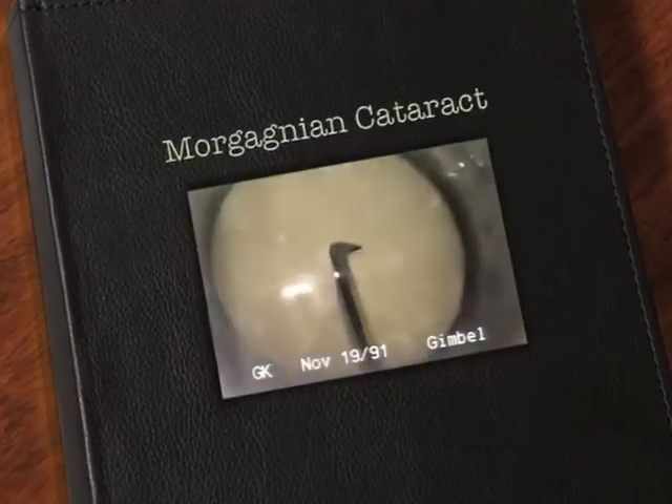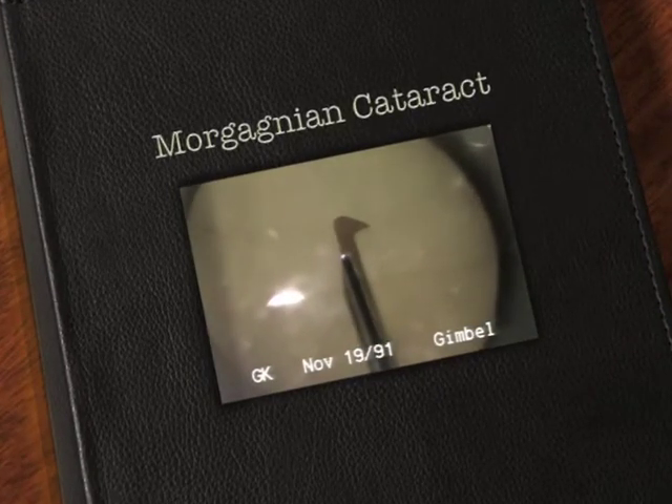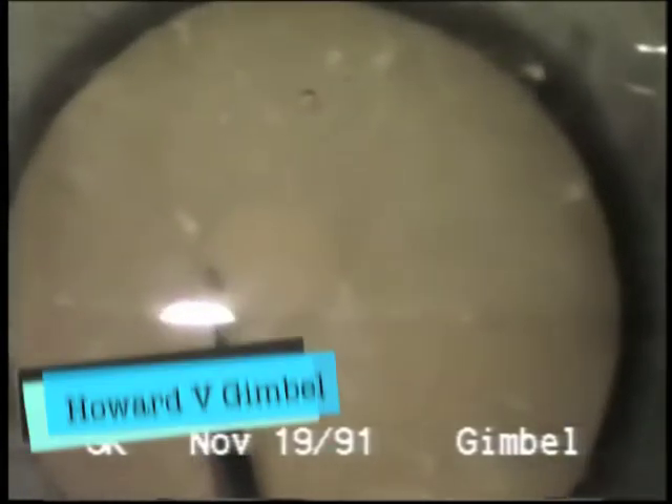This is Dr. Gimbel. This is an old video, but I thought some of you may run into situations like this without the Vision Blue that we have available now.